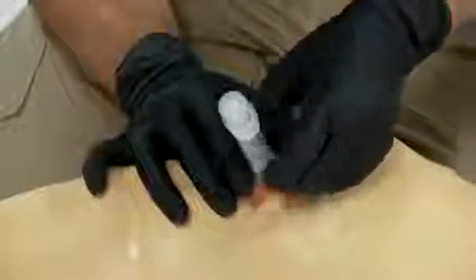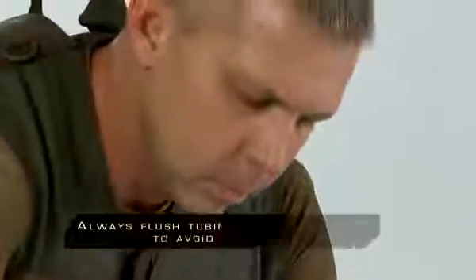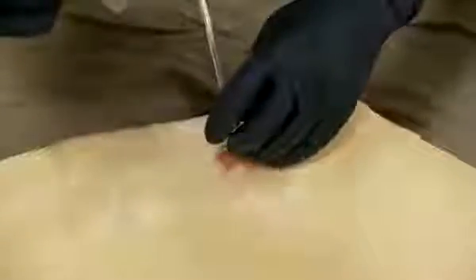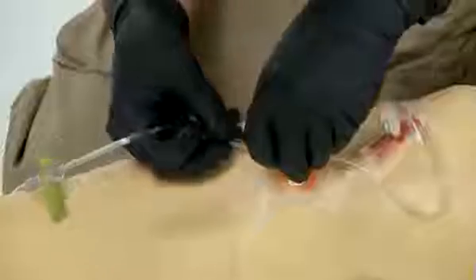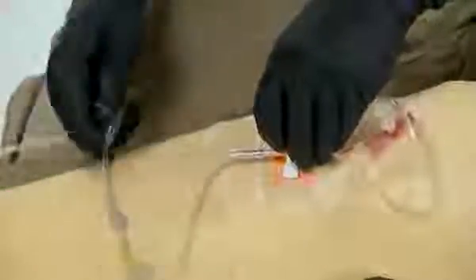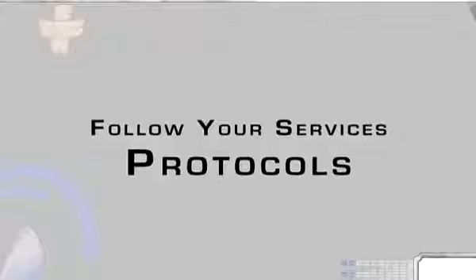Bone marrow can now be aspirated into a syringe for laboratory sampling. However, note that a lack of bone marrow does not mean the IO is improperly placed. Connect a stopcock or an extension set to the cannula. Flush 20 to 30 cc's of saline before injecting fluids or drugs. In conscious patients, consider administering a local anesthetic prior to administering fluids. Fluids and drugs can now be administered as required. As always, follow your service's protocols.